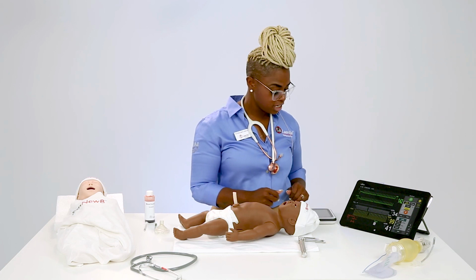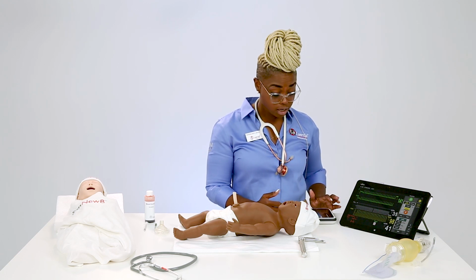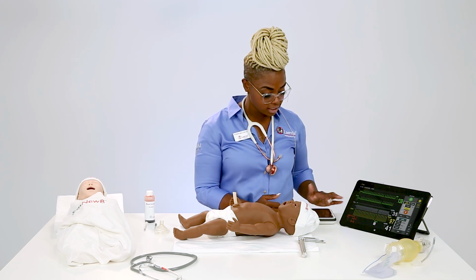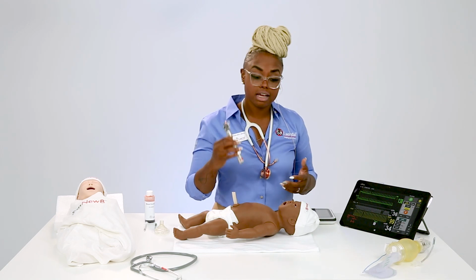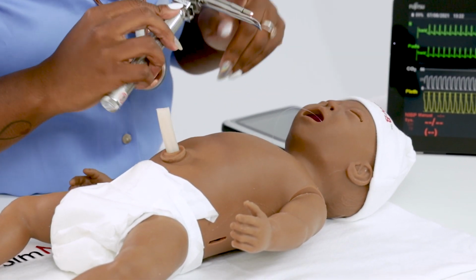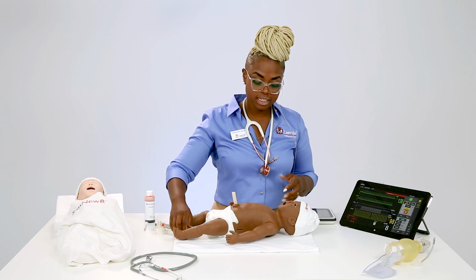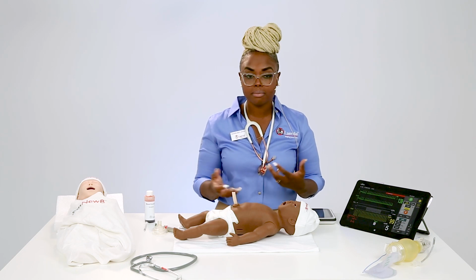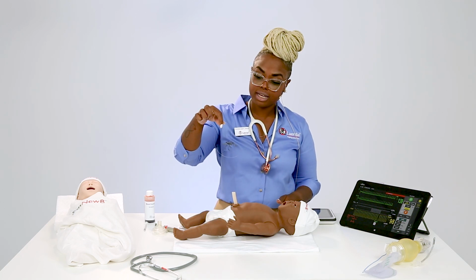At this point, just to take you through, if SimNewB is having an airway obstruction, he's not going to be crying, and he will have no chest rise and chest fall, and those are the things that you're going to check for. As a practitioner or clinician, I would then take either visual inspection or a laryngoscope and try to visualize if there's anything in there, because my laryngoscope has a light on it to see if there's anything occluding the airway. In that sense, I would then move forward with whatever protocol or policy I have for removal of that meconium, and then we would proceed with the simulation. So this is your simulated meconium.